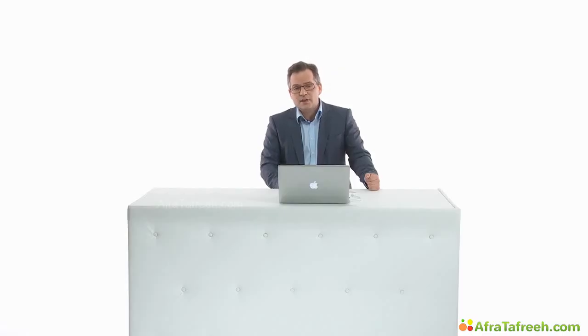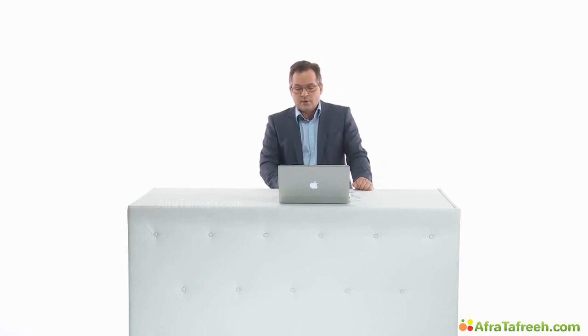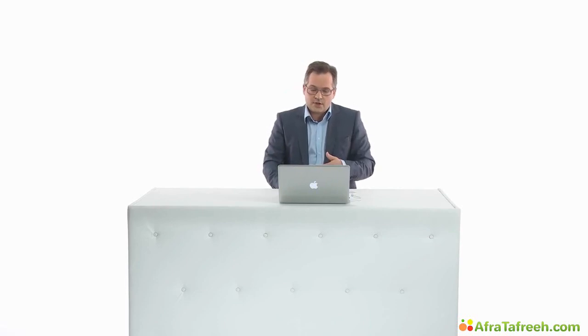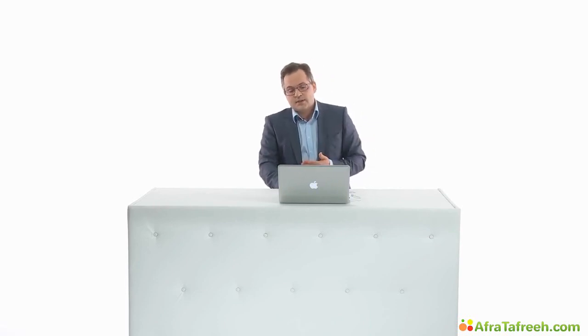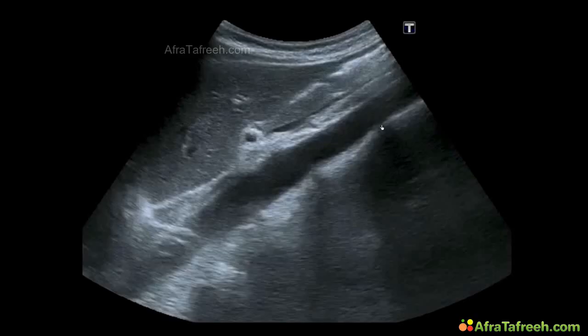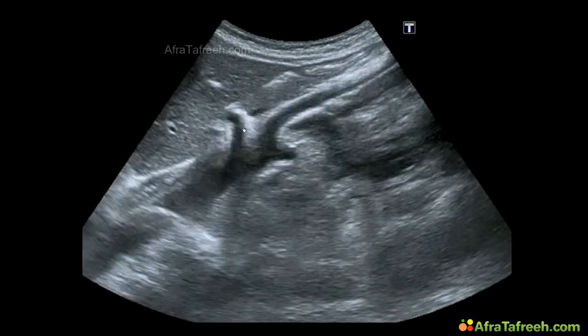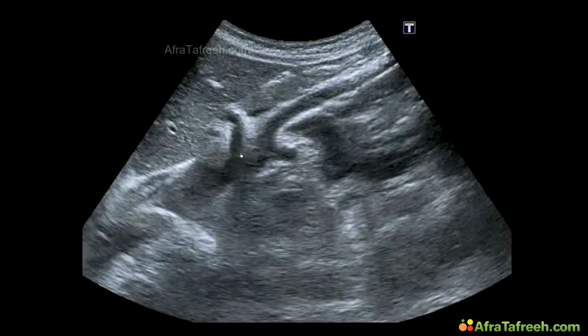There's another view we can use. It's the longitudinal view, but it's not so easy to detect the pancreas over here. But it's also fine to find the guiding structures, and the first guiding structure in this case is the abdominal aorta. So let's go for it. We scan in the midline and try to find this tubular structure, the abdominal aorta. It's a video clip I show you. Here, abdominal aorta and its branches, celiac trunk over here, and superior mesenteric artery over here.